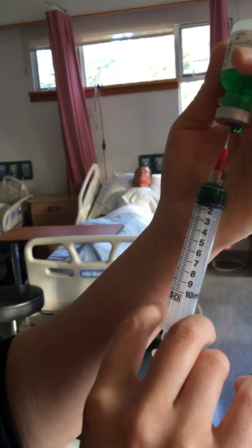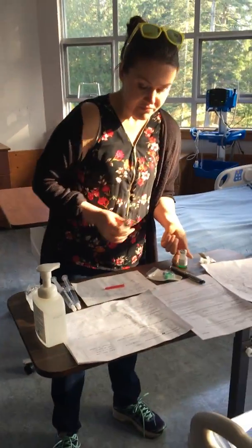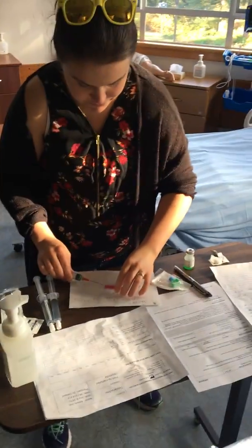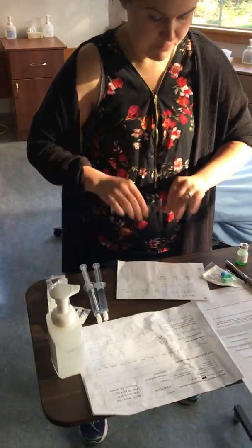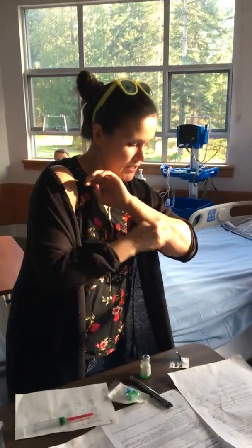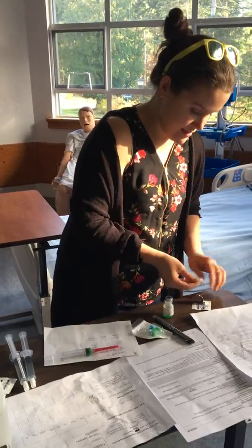There's too much pressure in this vial, so I'm going to hold the plunger while I make sure. Look, it's like leaking everywhere. Okay, apparently there's too much air in this vial. I'm going to recap this. Maybe use this alcohol wipe to get some of this green stuff off me. And there we go. Okay.